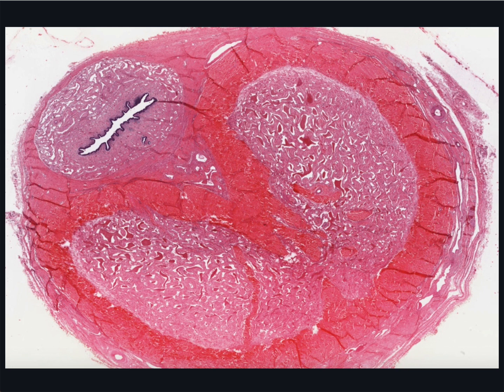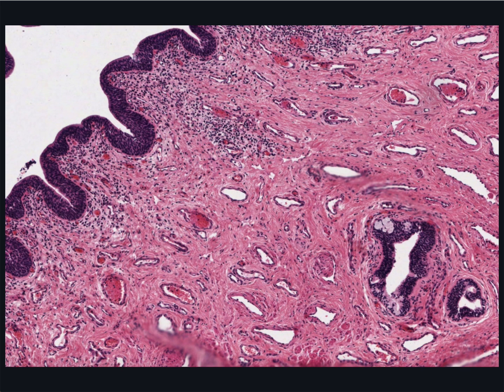This structure is in the spongy portion of erectile tissue of the penis. It's lined by stratified or pseudostratified columnar epithelium with patches of stratified squamous epithelium. As the urethra broadens to its terminal enlargement and opens at the apex of the penis, the epithelium becomes predominantly stratified squamous in form.